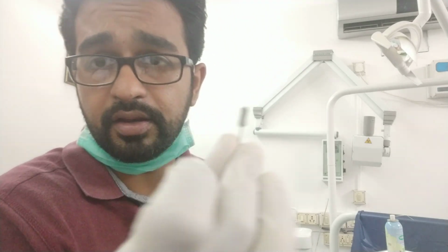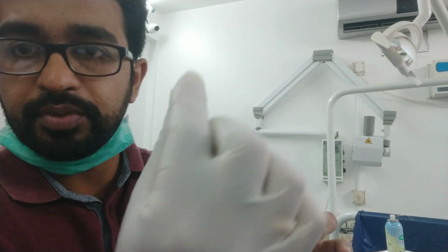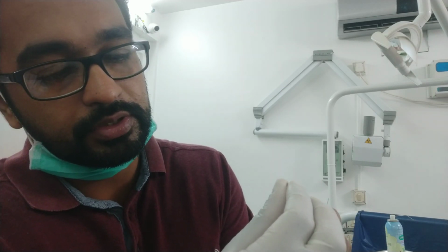You have to take a number 8 file. I have kept here many files for giving demos and all. Many students are also coming and they are learning. So this is a normal number 8 file, which is grey in color. You have to insert that file in a watch winding motion. Watch winding motion like this. You have to hold the file and do like this. You should not rotate it all the way. You should do it in a watch winding motion, and you have to just insert it.